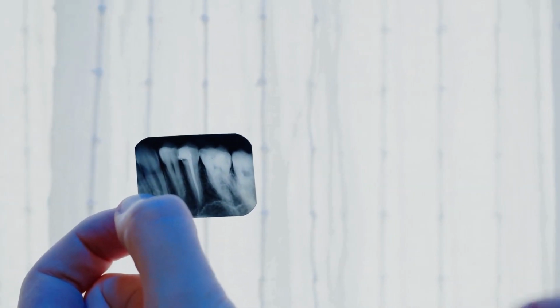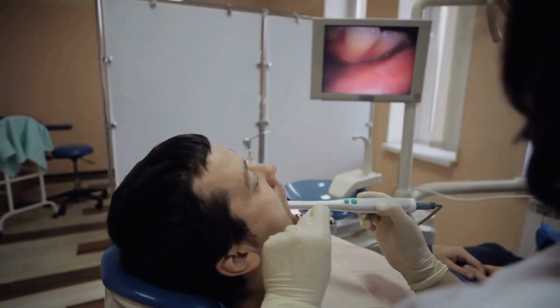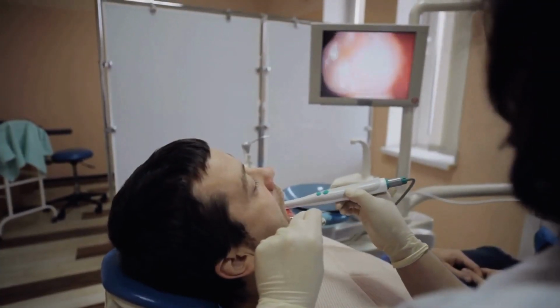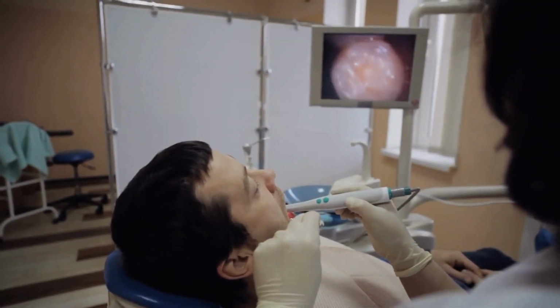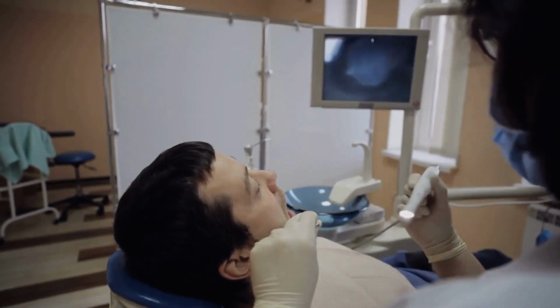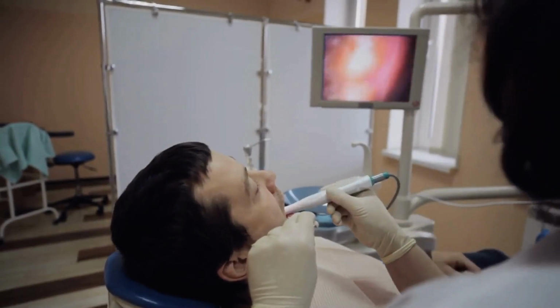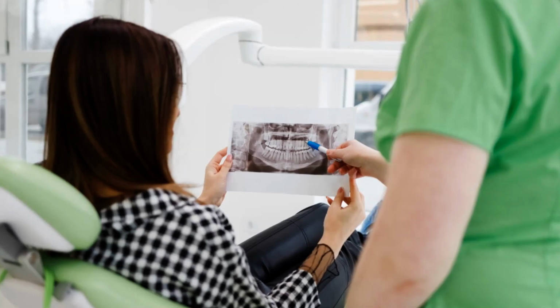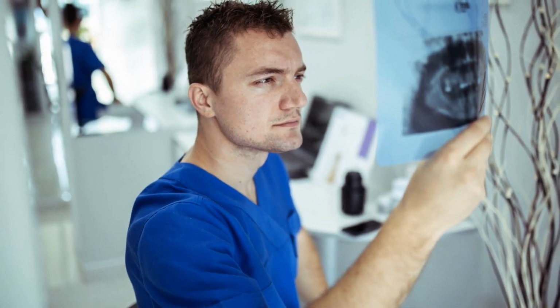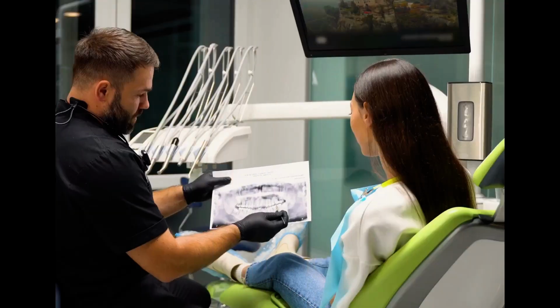Furthermore, cross-polarized photography proves invaluable in detecting and monitoring other dental issues, such as wear patterns, enamel defects, and subtle changes in tissue texture. By providing a clearer and more detailed view of the oral cavity, this technique empowers dentists with the visual information they need to make accurate diagnoses, assess the severity of dental problems, and develop effective treatment plans. In essence, cross-polarized photography acts like a magnifying glass, revealing the hidden details that hold the key to understanding and addressing a wide range of dental issues.